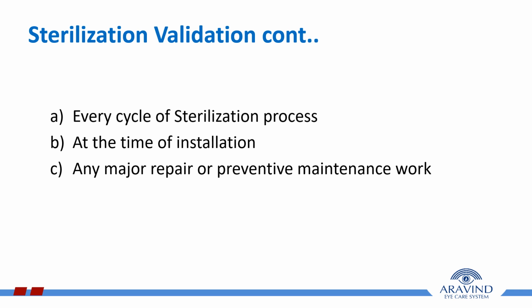When should the validation be performed? It should be performed in every cycle of the sterilization process. Whenever a new sterilizer machine is installed, it should be validated. And if any major repair or preventive maintenance work is carried out, sterilization should be validated.